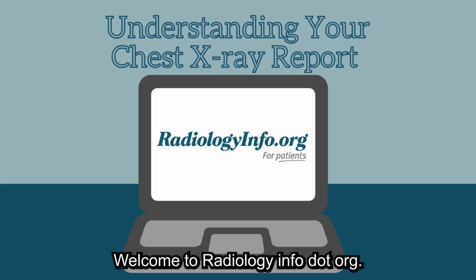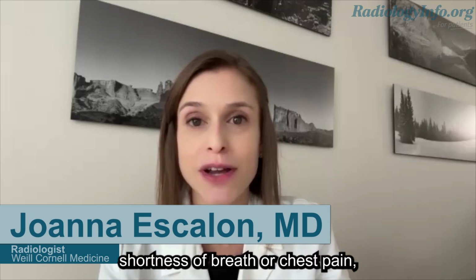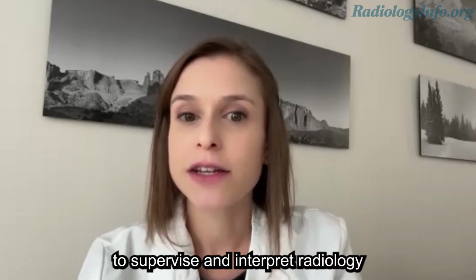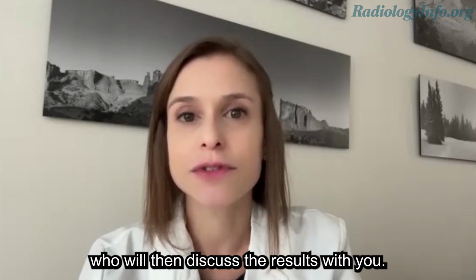Welcome to radiologyinfo.org. A chest x-ray helps your doctor diagnose the cause of symptoms such as fever, cough, shortness of breath, or chest pain, and to diagnose diseases of the lungs and heart. Your radiologist, a doctor specially trained to supervise and interpret radiology exams, will analyze the chest x-ray images and write a report for your healthcare provider, who will then discuss the results with you.